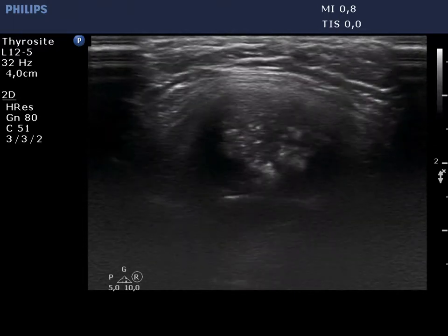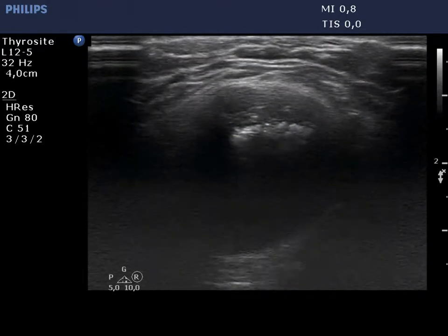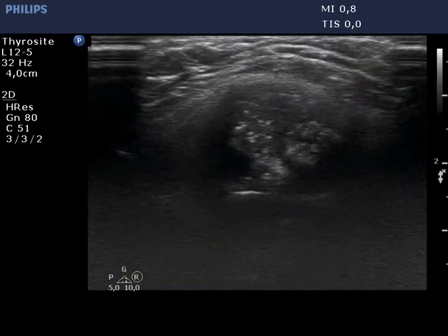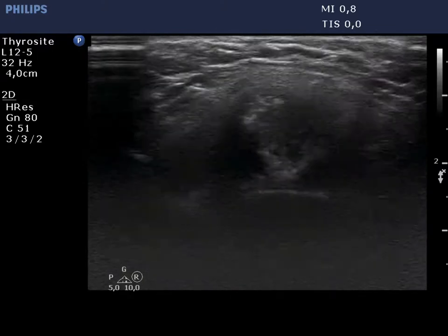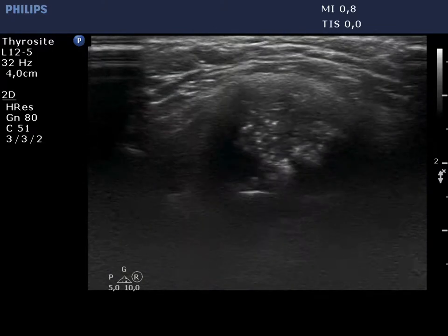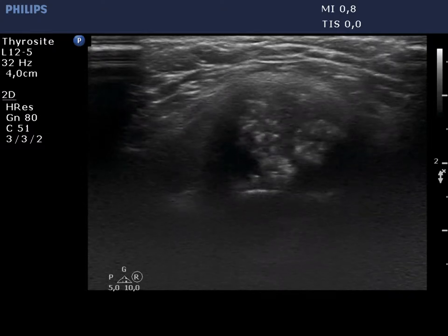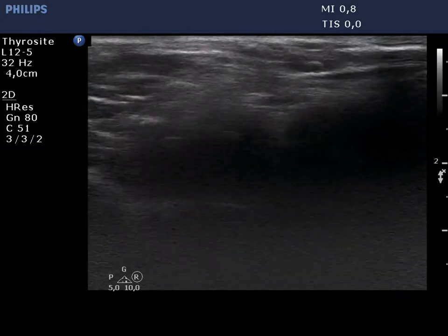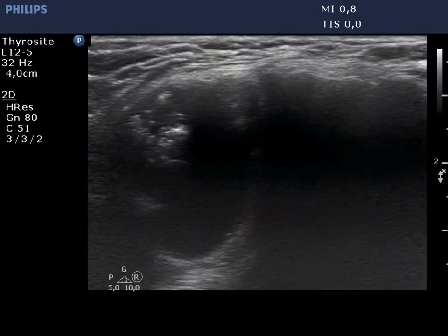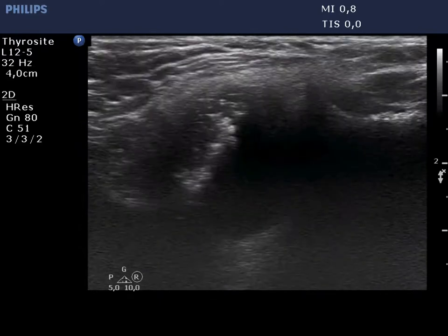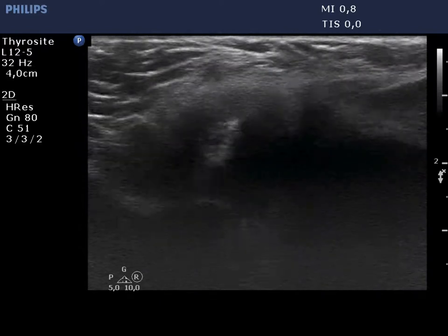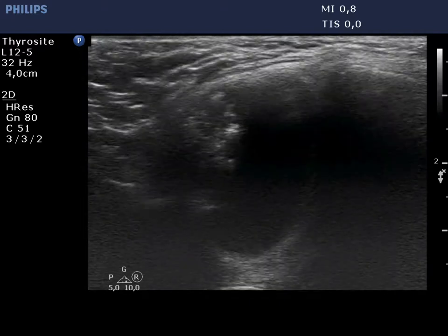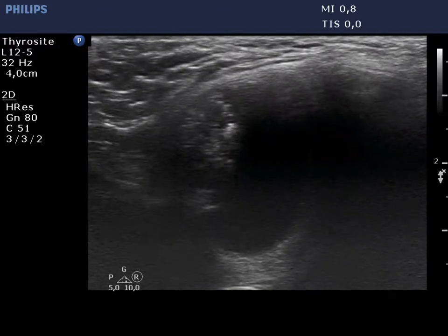There is a large mass in the middle part of the neck, 5 cm above the thyroid. This is a peripheral type cystic lesion. The solid part has numerous echogenic figures including microcalcifications. Now, the mass on longitudinal scan. The solid part is hypoechoic and it is located in the upper pole of the lesion.